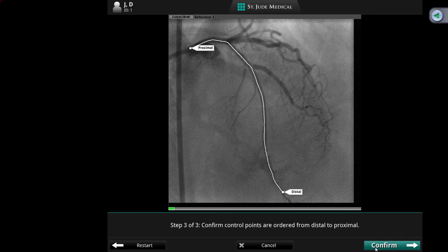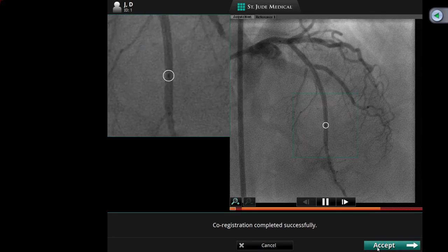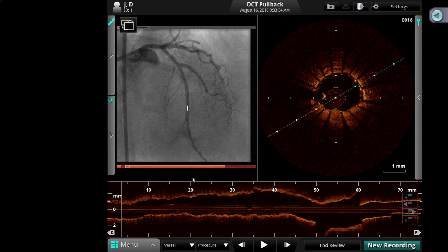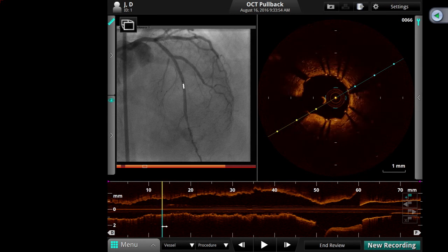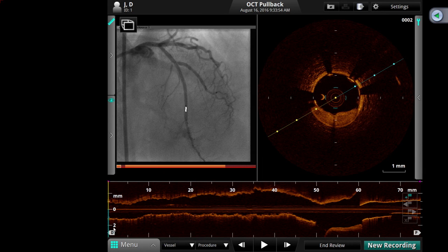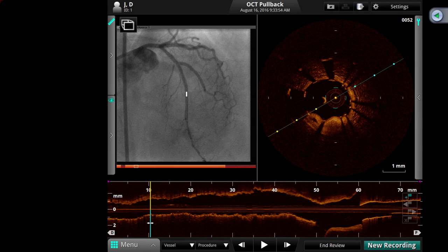That BVS that did not cross, give it back. Put down both the BVS. You did the thing? Coverage is done. Yes. So this is where. Okay, BVS show cross. We are coming from distal to proximal. They're seeing it, right? You can see the co-registration, right?